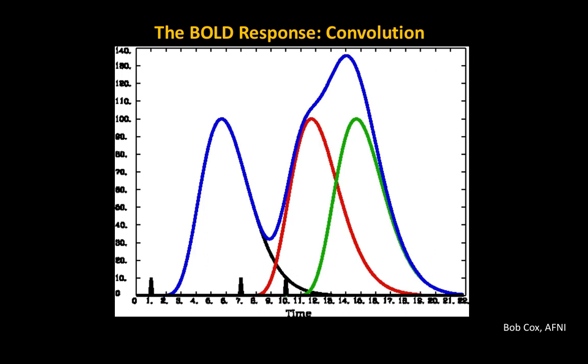So translating this to diffusion data, we have this pretty complex diffusion signal from a single voxel that we assume is constructed from a bunch of these fiber orientations in all different directions. But we try to decompose it using a single fiber orientation but in different directions. Then we add those up to get the original signal. Clear as mud? Yeah? Okay.